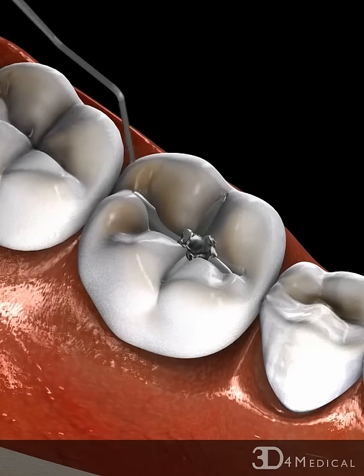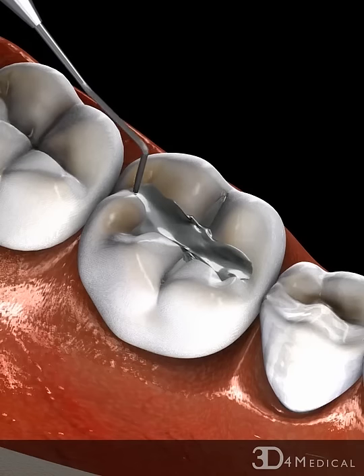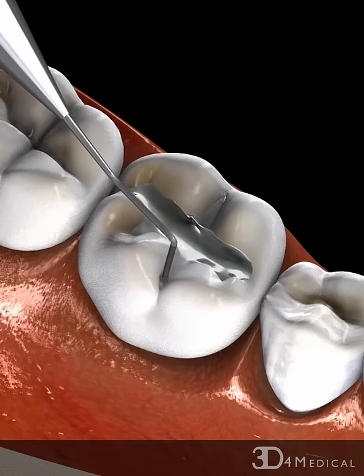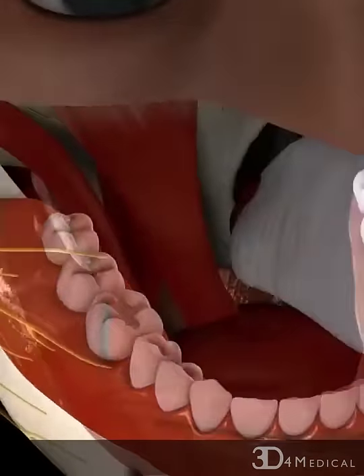This process is repeated as many times as is needed to build up the layers of amalgam until the filling process is completed.